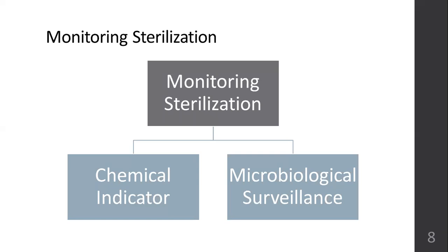Monitoring the sterilization. How will you ensure that the sterilization that you have done is good, it was adequate? How will you ensure that? So we have indicators for that. Okay, you have chemical indicators and microbiological indicators.